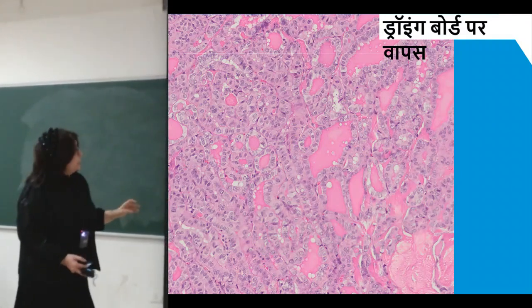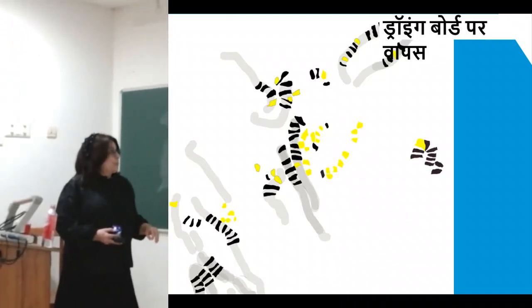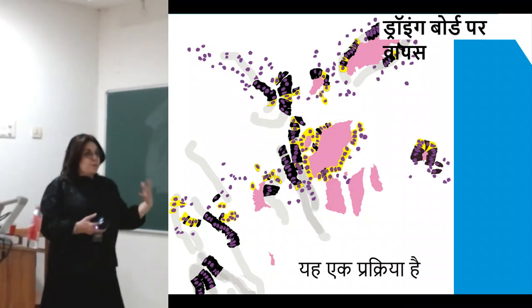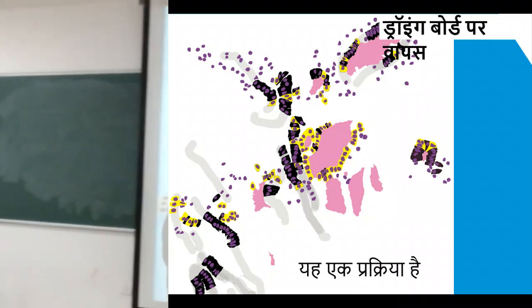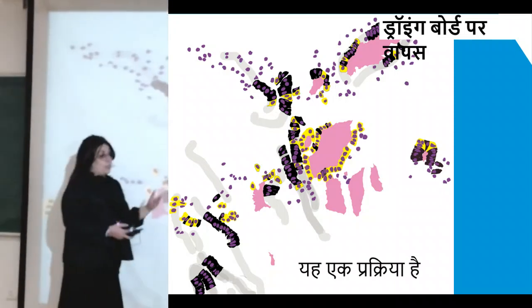So back to the drawing board again. What we decided is we're going to go to machine learning, and machine learning on H&E, which is going to give us a very rich array of nuclear features and colloid, which will help us complete the cells. The black here are hand-annotated tall cells, where the yellow are hand-annotated not tall cells.